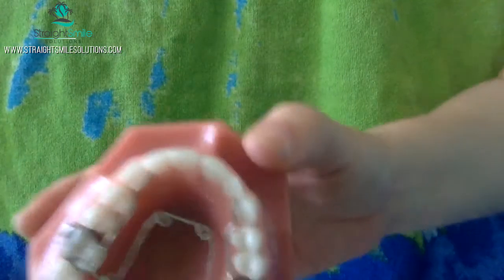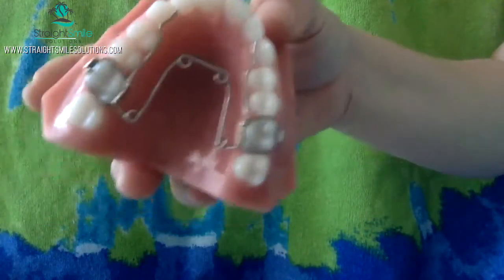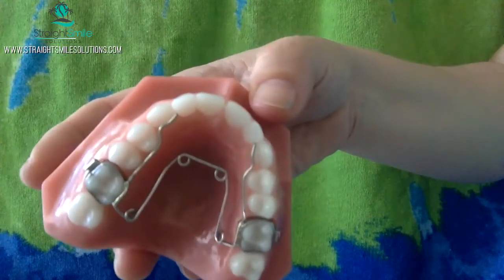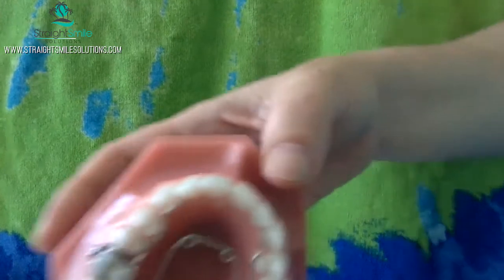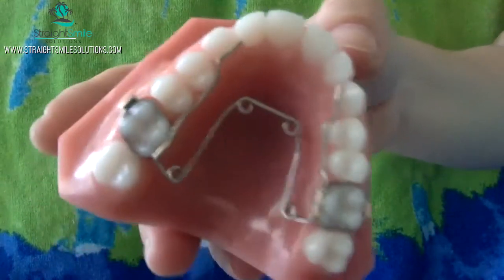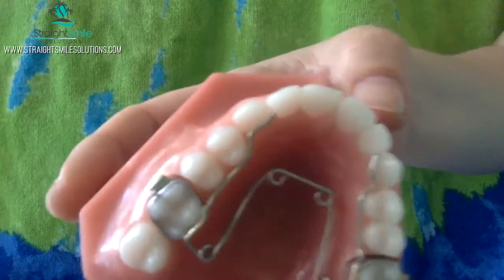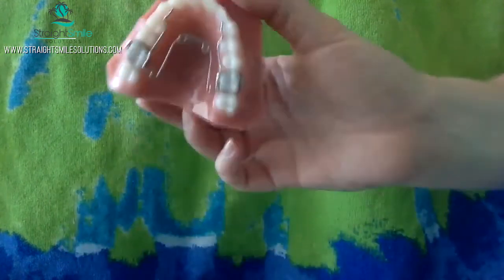This is Dr. Amanda with StraightSmile Solutions, and today we're going to be talking about QuadHelix. What's old is new again, and I never stopped using these. I think they're great appliances and people are starting to find their use again. I just wanted to give a quick shout out and thank you to Specialty Appliances for sending me the demo of this model so that I could teach you guys how to design one and how to deliver it in a patient. We'll talk a little bit about indications for use.